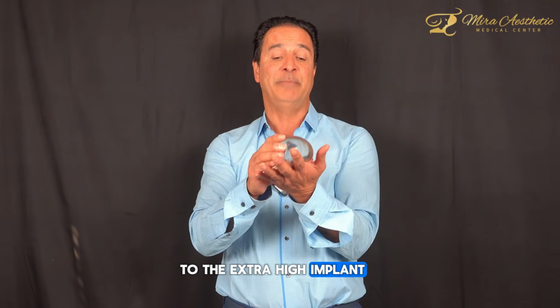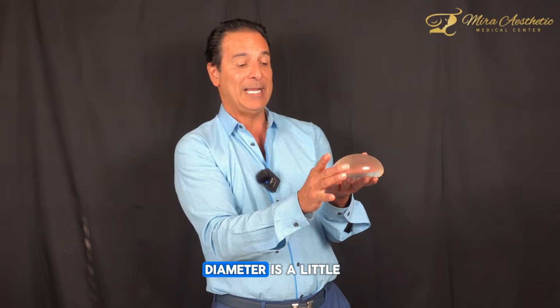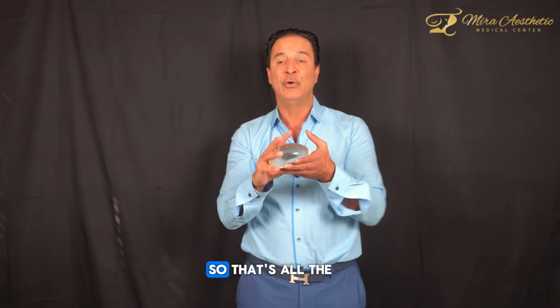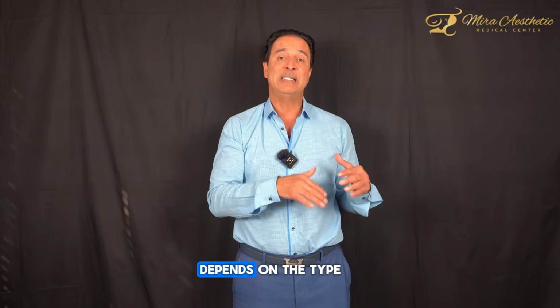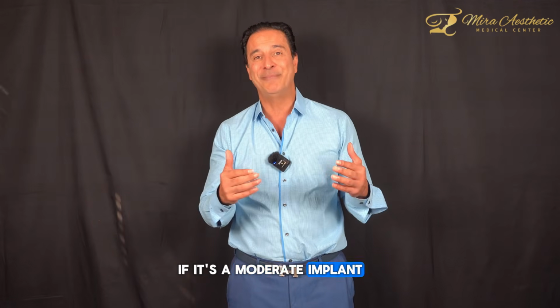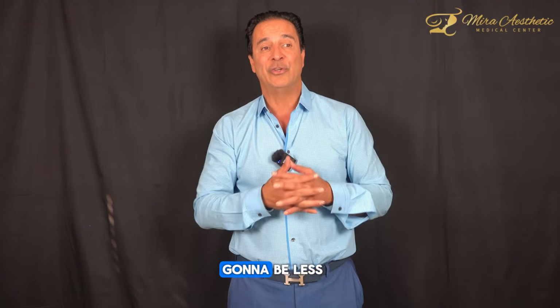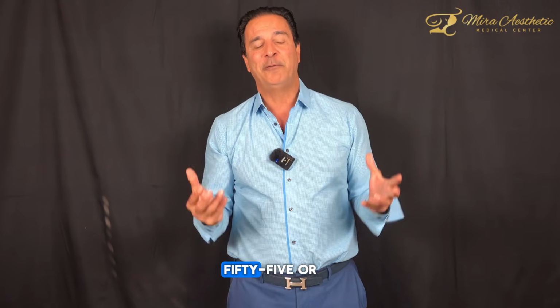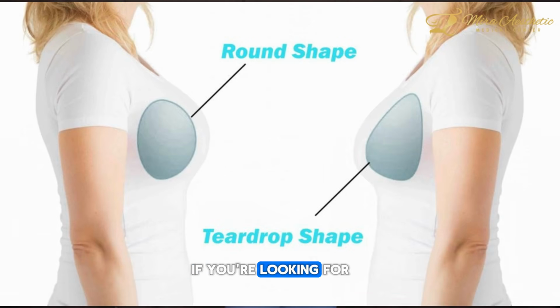Now, if you go to the extra high profile implant or the boost implant, you can see the diameter is a little bit narrower, but the projection is higher. So the 45-55 or 60-40 also depends on the type of implant you are using. If it's a moderate profile implant, then again the diameter is going to be wider and the projection is going to be less. So I think the 45-55 or 60-40 rule is a good rule to follow if you're looking for a natural looking breast augmentation.